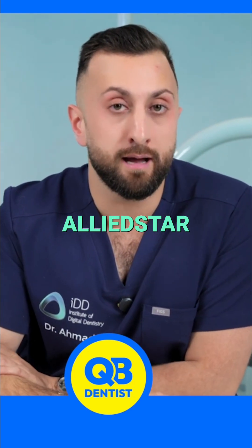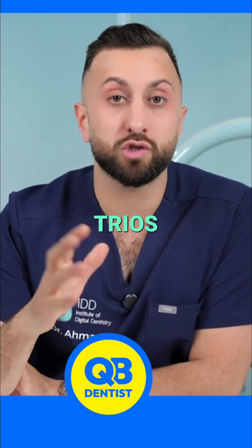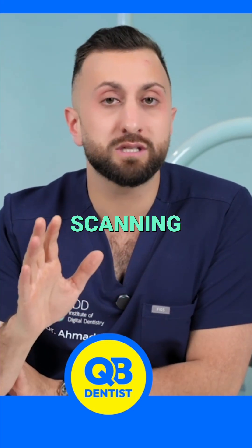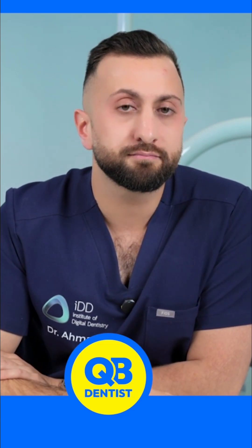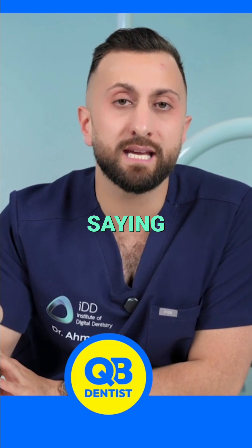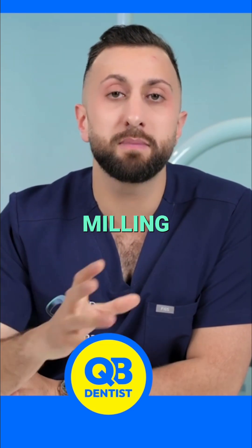If you want to do a lot of edentulous scanning but you're on a budget, one of my favorites is Alliedstar — very good performance. The software is not as good as Trios, but very good scanning performance for the price. If you want to do chairside CAD/CAM, it goes without saying that Cerec with a milling machine is one of the best milling combinations.